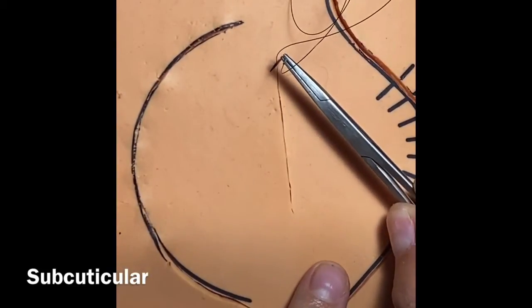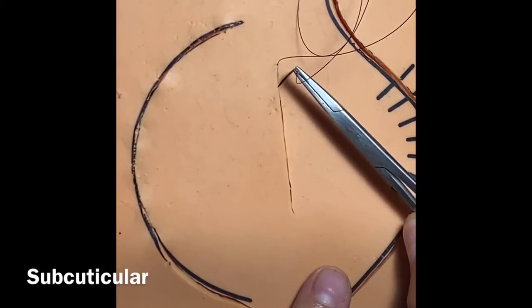What you're going to do, I'm just going to show you kind of a line, is you're going to suture within the layer of the skin and move down the skin edge in this direction until you get to the end and we're going to tie it here.